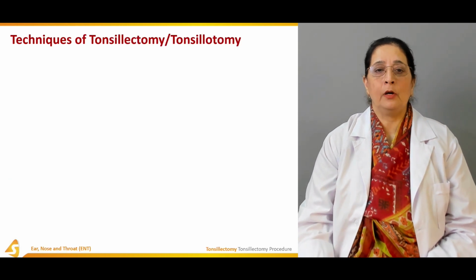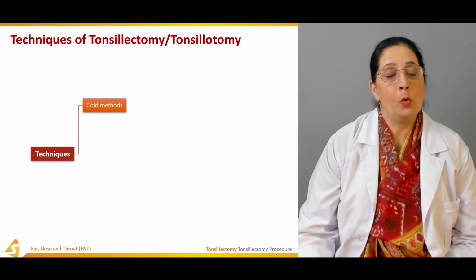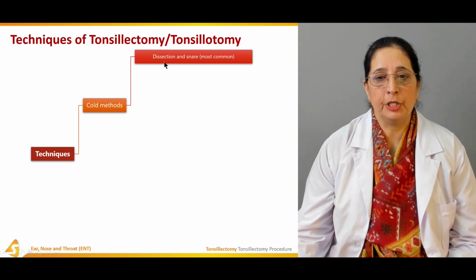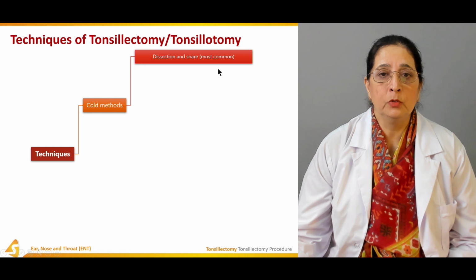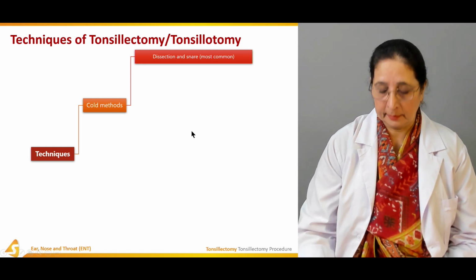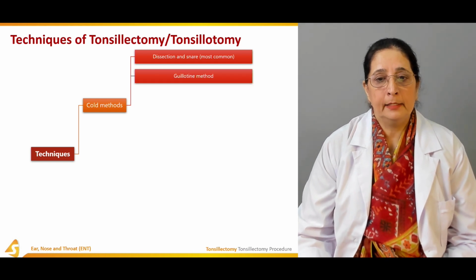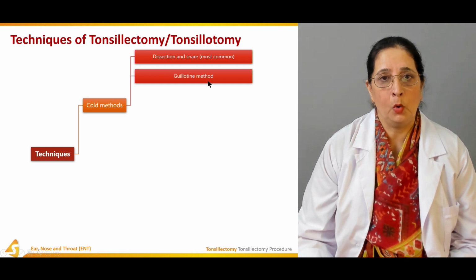So, techniques of tonsillectomy. We have cold methods. In cold methods, we have the dissection and snare method, which is the most common method used for tonsillectomy. Then we have the guillotine method, which is also a cold method.